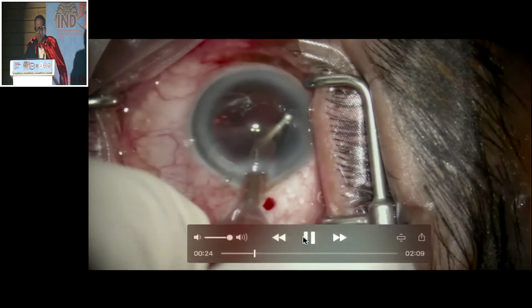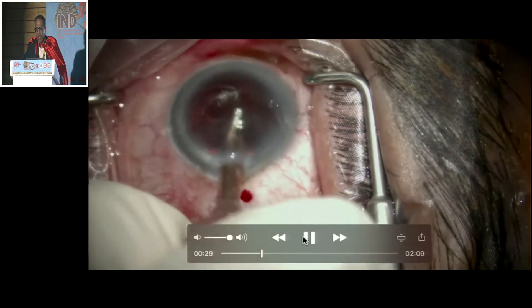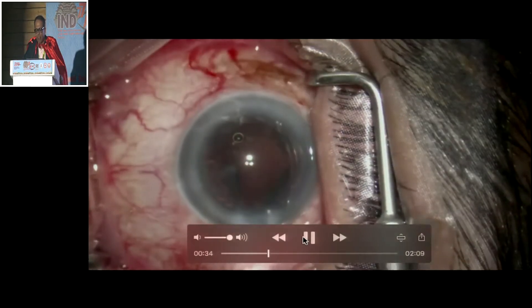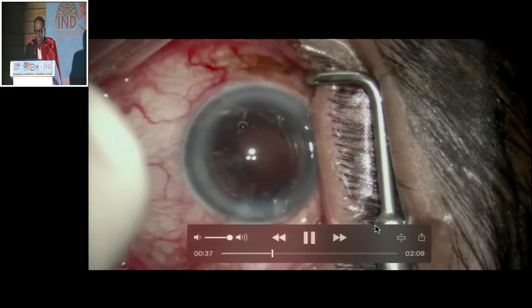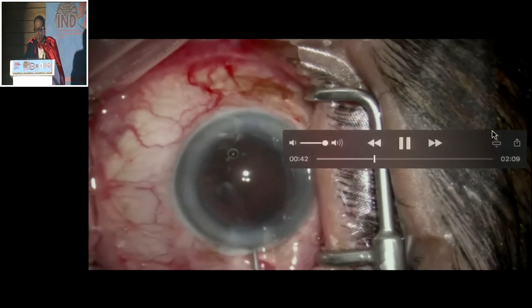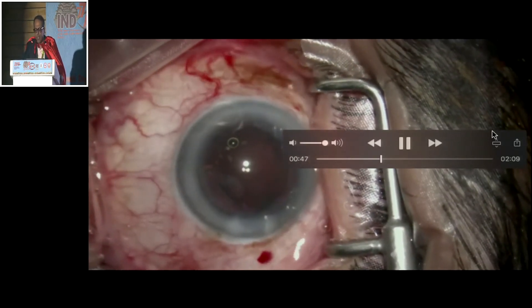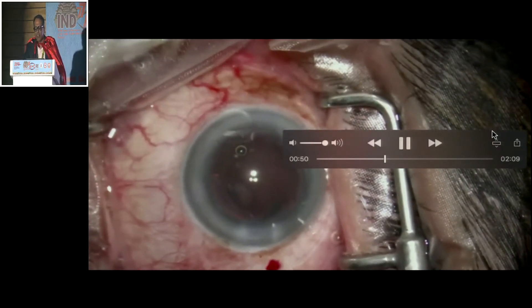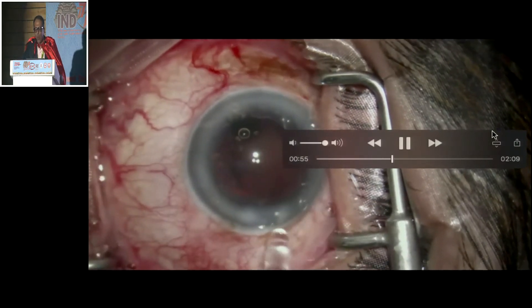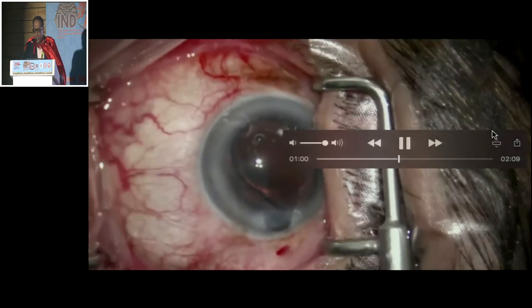Now the posterior capsule was becoming convex. There was paucity of space in the anterior chamber. I decided that enough is enough — I took it out, and you will see there is burping of visco. So there is a hard eye now. Either it is a suprachoroidal leak or there is a fluid misdirection syndrome. I think: why not put an IOL as a scaffold and see if I can proceed?